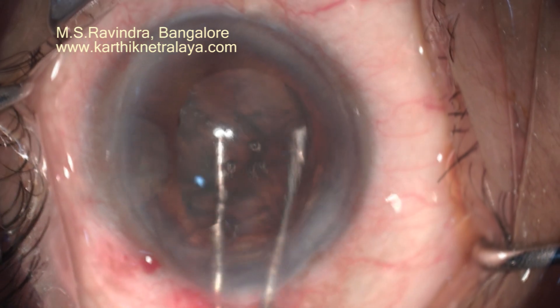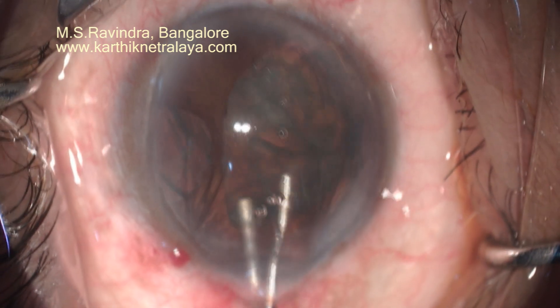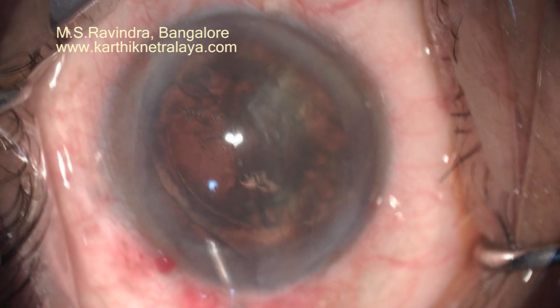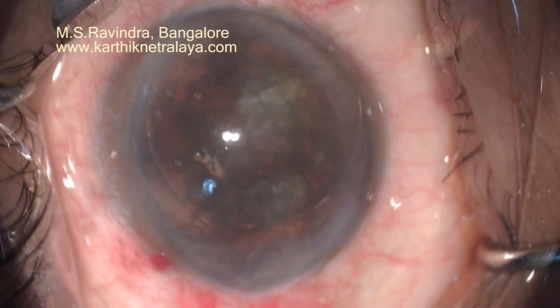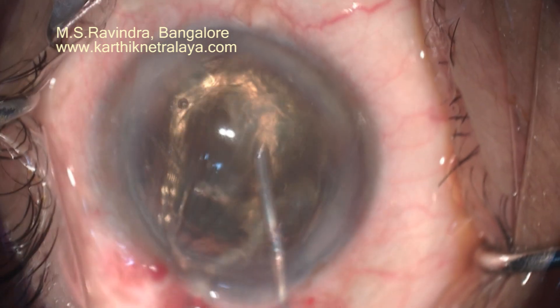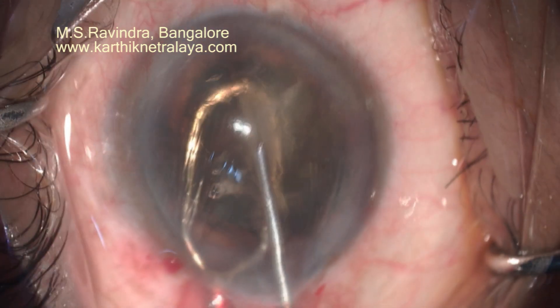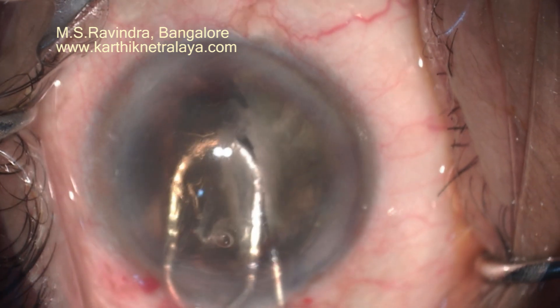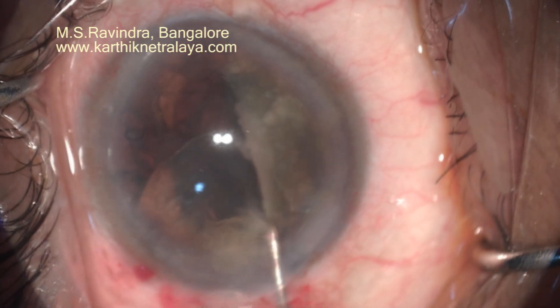The nucleus-epinuclear mass is rotated. One edge is lifted up with a 26-gauge cannula and rotated into the anterior chamber. See that there is no traction on any part of the zonules at any point of time. Rotation of the nucleus-epinucleus distributes the pressure all around the circumference of the zonules, so there is no single point pressure, pull, or push on the zonules.